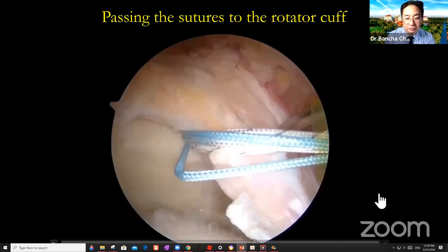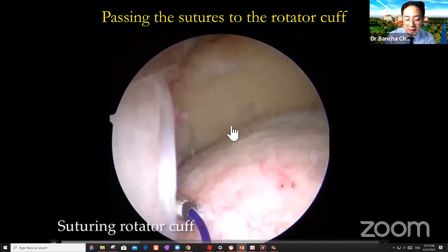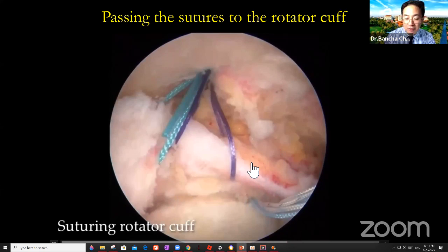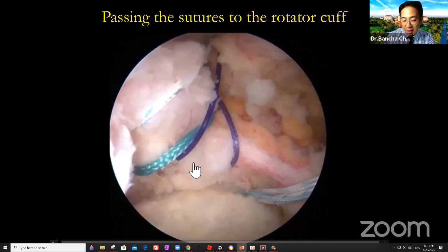After that, we're passing these sutures into the rotator cuff. So this is like you do the side-to-side repair. We do this the same in front and back, okay? This way. And also, I pass my suture into the rotator cuff. So after I repair my SCR, I will put my graft underneath the stump of the rotator cuff. So you have two surfaces of healing. One is healing on the glenoid, and then also you have healing on the rotator cuff, okay? So I will pass my suture in different colors. You see that this blue, this green, right? So this soft tissue will cover the rotator cuff again after you tie the knot on the glenoid, okay?